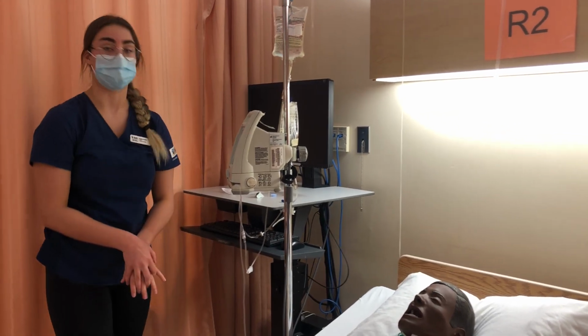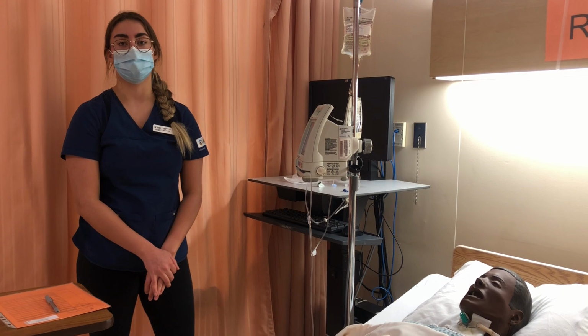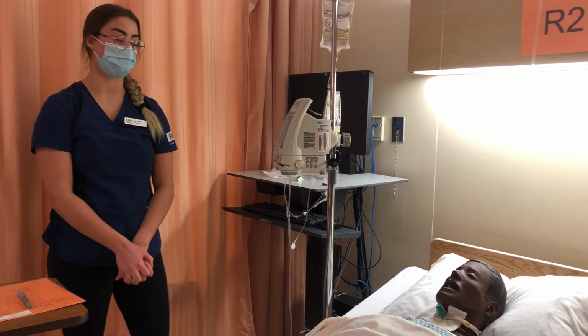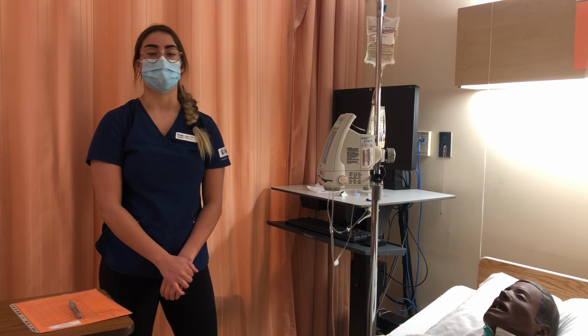So I will do my exit safety check. The bed's in lowest position, the call bell's within reach, the patient isn't in any distress in terms of their ABCs, and my lines are running at the correct rate. So once I'm done that, I can leave the patient's room and document on the fluid balance chart the amount of volume that I'll be instilling today.